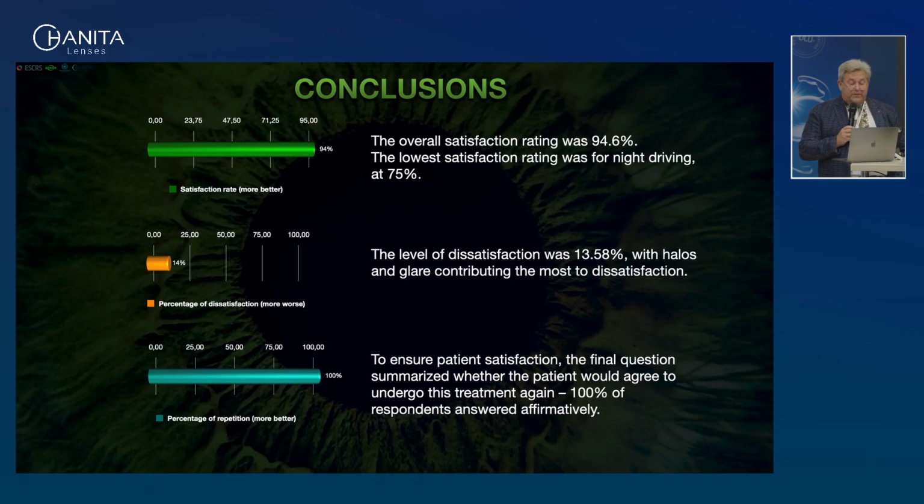So the overall satisfaction rate was near 95%. The lowest satisfaction was night driving, just 75%. The level of dissatisfaction was 13.5%, with halo and glare contributing most of the dissatisfaction. To confirm patient satisfaction, the final question asked whether the patient would agree to undergo this treatment again, and 100% of respondents answered positively.